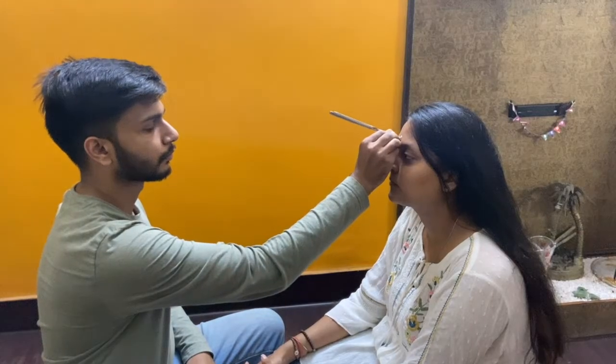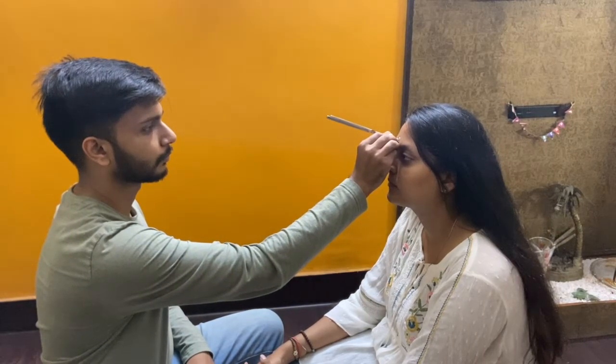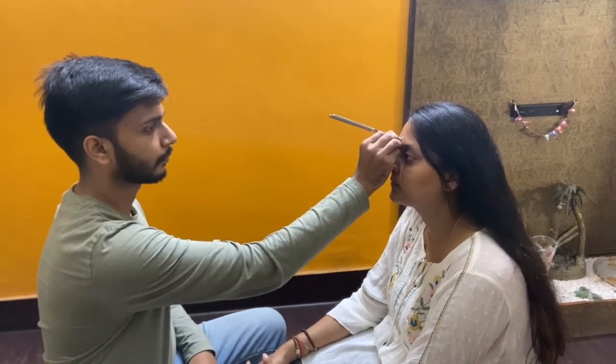Now test for lateralization, that is the Weber test. For this I have to place the tuning fork on the top of the patient's forehead. Now I have to ask the patient, do you hear any sound on both ears? Normally sounds should be heard equally on both ears.